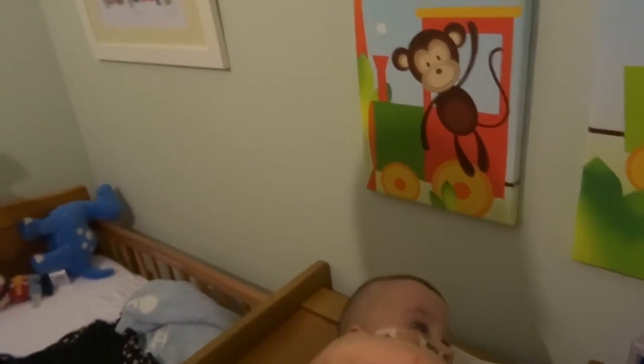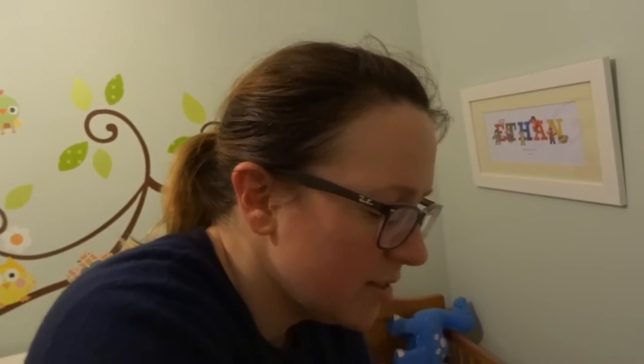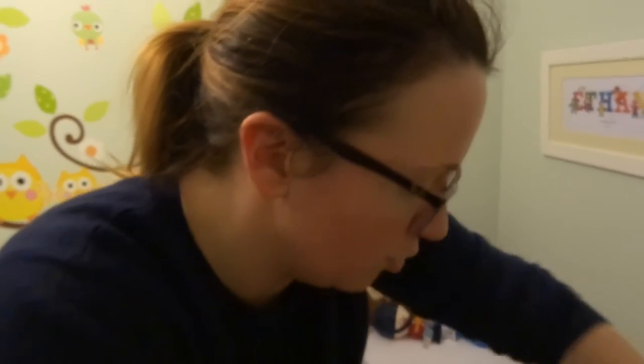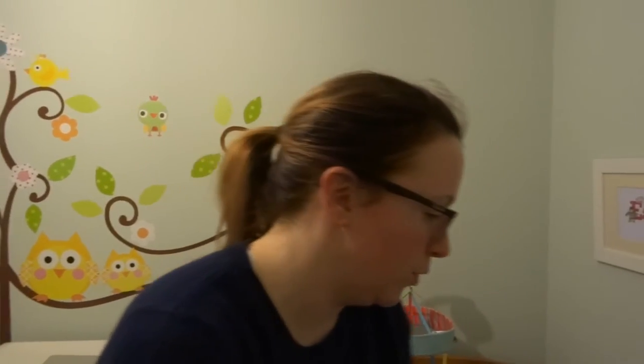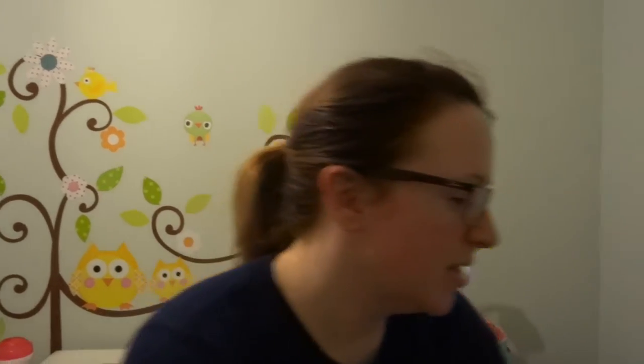That's 9.805 kilograms today, which is quite normal for Ethan — he's been hovering around there for a while. He was 9.775 this morning, so he hasn't put on a massive amount of weight, which is good. If he's above 9.9 we'd think about putting him on a stronger mix bag to get a bit more fluid off, but 9.8 is okay. Working out when he needed stronger fluid was something we thought we'd never get to grips with, but we've come to understand it quite well.